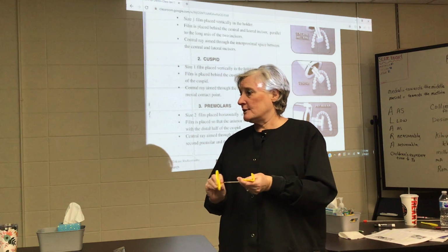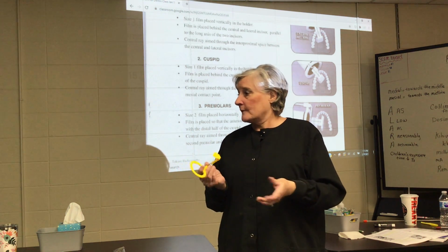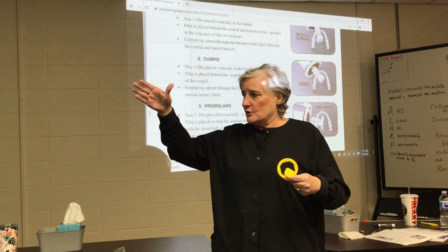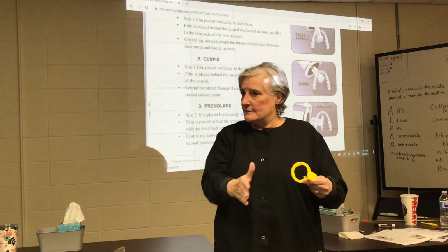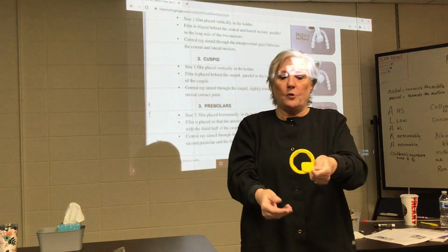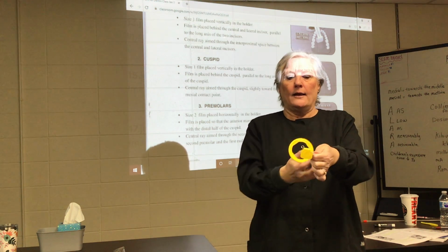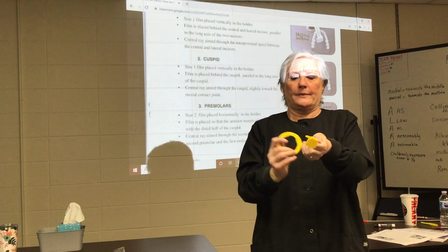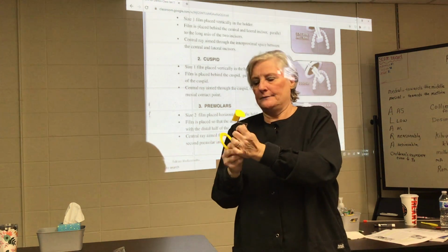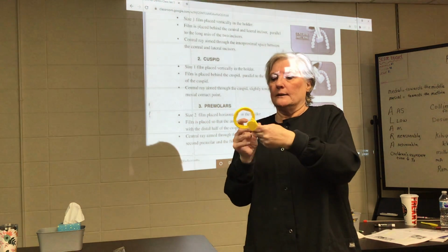All I have to do is change it one more time, and then I'm right there. Okay? So it helps me to keep track of me and answer the questions and still deliver excellent care to my patients. So hold it towards you, roll it over, place the bite block, then roll it over with the ring. Simple. It's just a two-step process when the ring wants to cooperate.